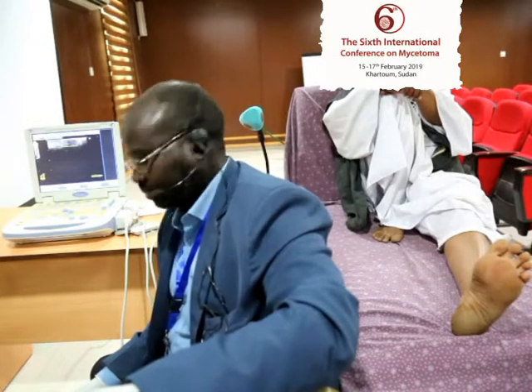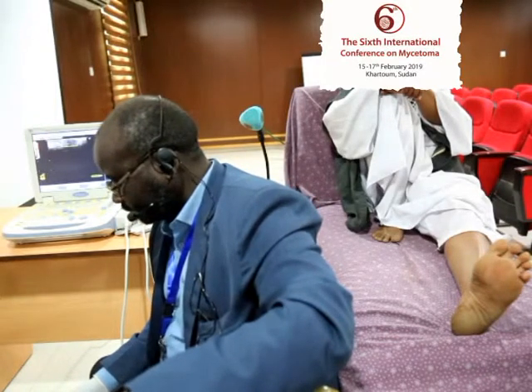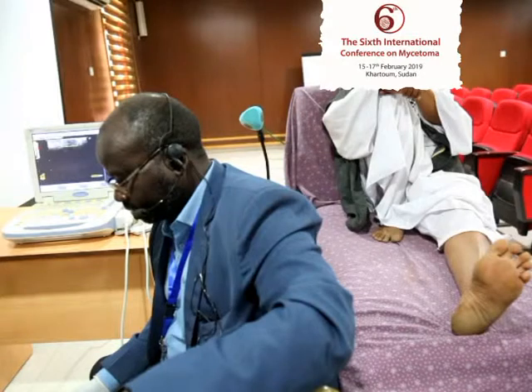As Dr. Mustafa said, it's difficult to have a very clear conclusion that this is an actinomycetoma from ultrasound. But it will tell you this is a mycetoma lesion. This is an important issue. The other thing is the size of the grains and where the grains are, at the bottom of the cavity or floating in the fluid. This is an important differentiation between the two. But I don't think the melanin has a lot to play in differentiation between the two. So it will be the size and the way the grains lie within the cavity itself.